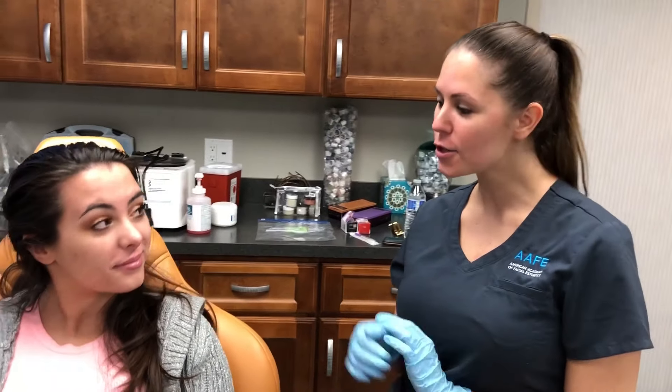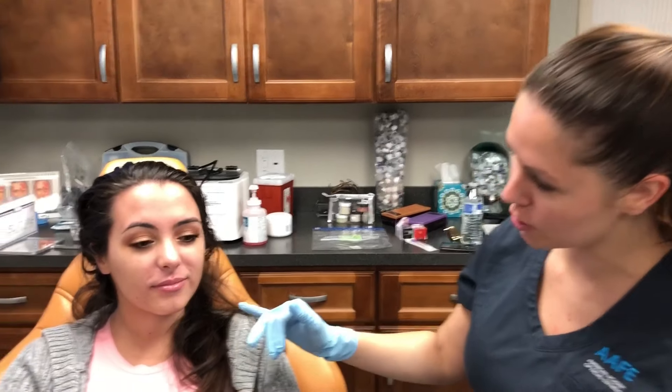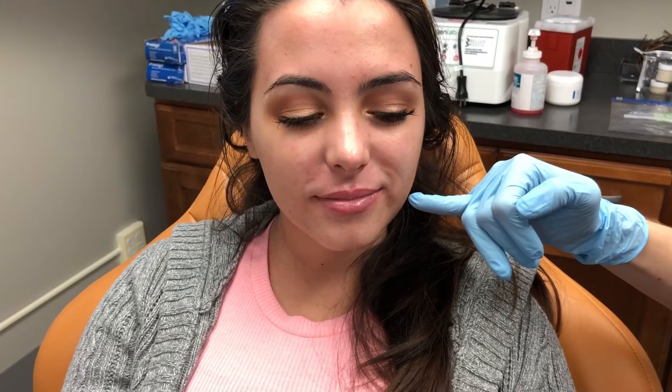Hi, I'm Ashley, nurse faculty member here at the AAFE, and today Julia is our patient. We are going to do her nasolabial folds because they bother her. As you can see, she has some asymmetry — she used to sleep on the left side of her face, so her fold on the left side is a little bit deeper. We're going to start on that side today and help fill it in. I'm going to be using Juvederm Ultra — not the Plus — because her fold isn't that deep and she's younger.